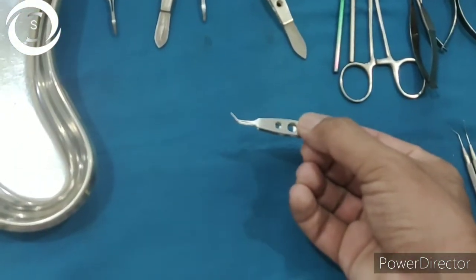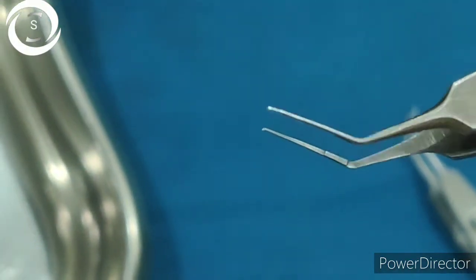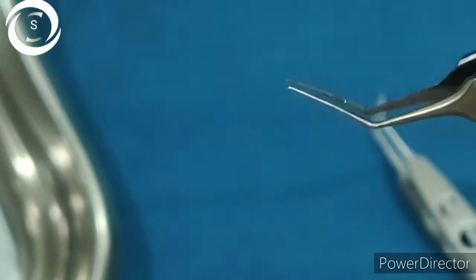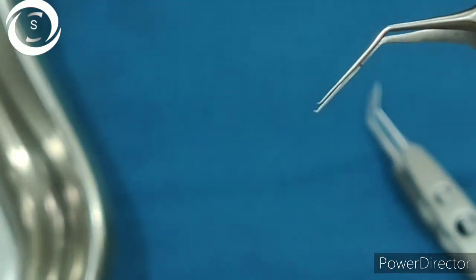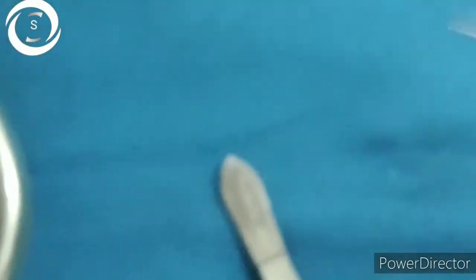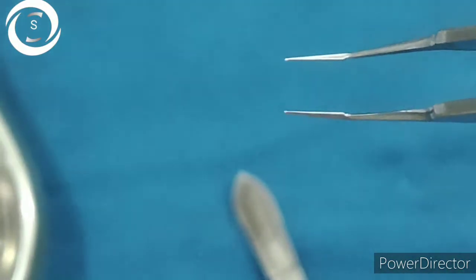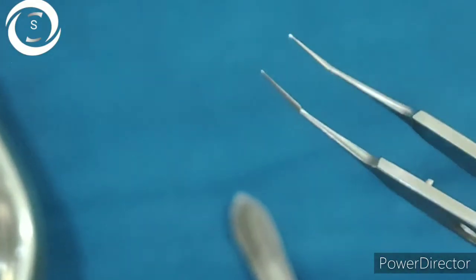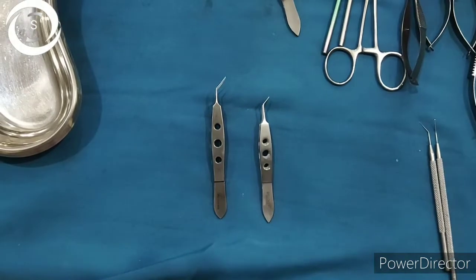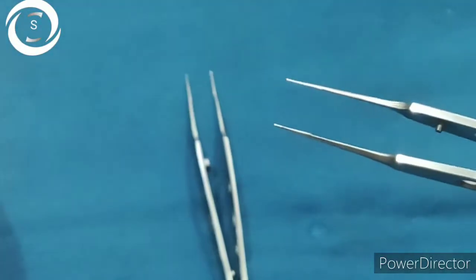This is the curved plane forcep, also called Macpherson. The larger instrument with pointed curved ends is called Utrata, or capsulorhexis forcep. The difference is that the capsulorhexis forcep is larger and has pointed curved ends, whereas Macpherson has no curved ends. Macpherson is used for tying sutures and implanting the intraocular lens, while Utrata is used for capsulorhexis.